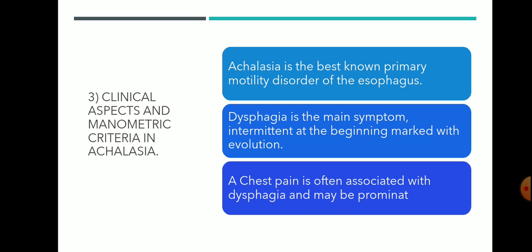On the basis of the manometric findings, achalasia is easily differentiated from the primary motility disorders, that is diffuse esophageal spasm and nutcracker esophagus, but nonspecific esophageal motility disorders are frequent. Manometry is also an objective method to assess the effectiveness of the treatment, that is the surgical myotomy or the balloon dilation of the lower esophageal sphincter.